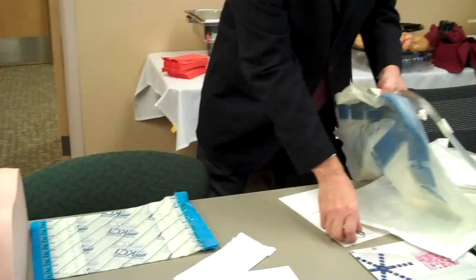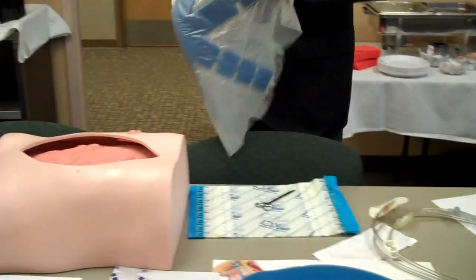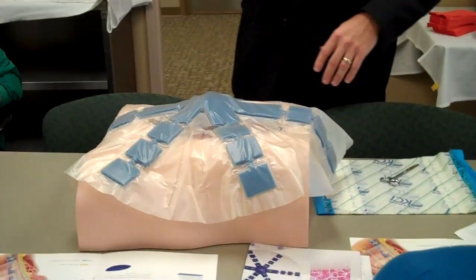After you've done your abdominal washout and you're ready to close your patient, you want to size the visceral protective layer.